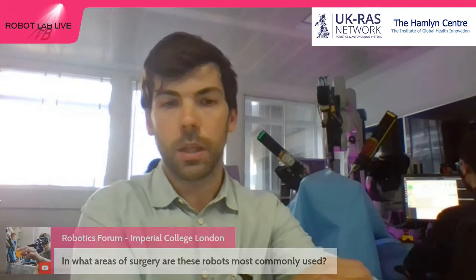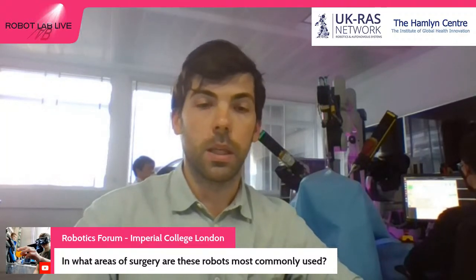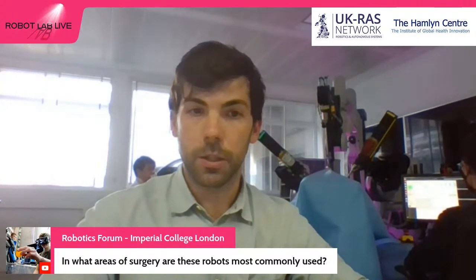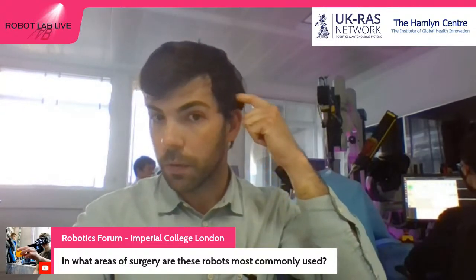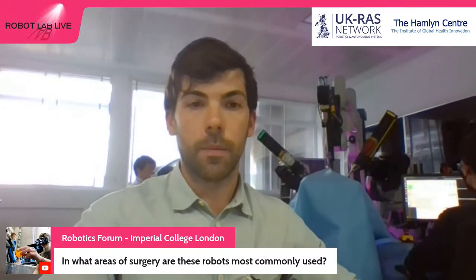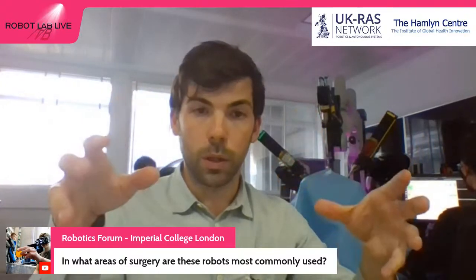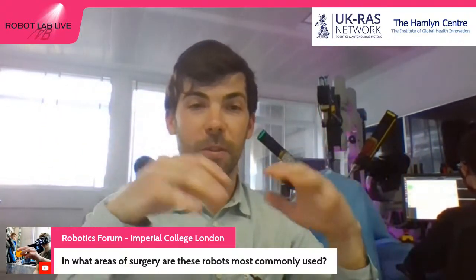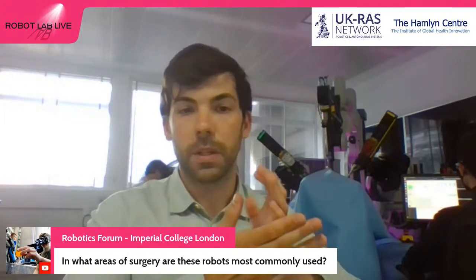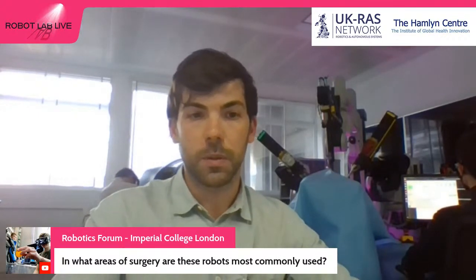But yeah, coming back to the question, sorry, it is normally laparoscopic surgery, but this robot has been used in cardiac surgery and also in ENT surgery, for instance, in cochlear implant surgery, which is the surgical procedure of implanting these hearing devices in this area. We have the facial nerve that we try to avoid. And in the goggles that Sen is using to control the arms, we can introduce very cool augmented reality features that guide the surgeon to avoid, in this case, the facial nerve. So yeah, they can be used in many different surgical procedures.